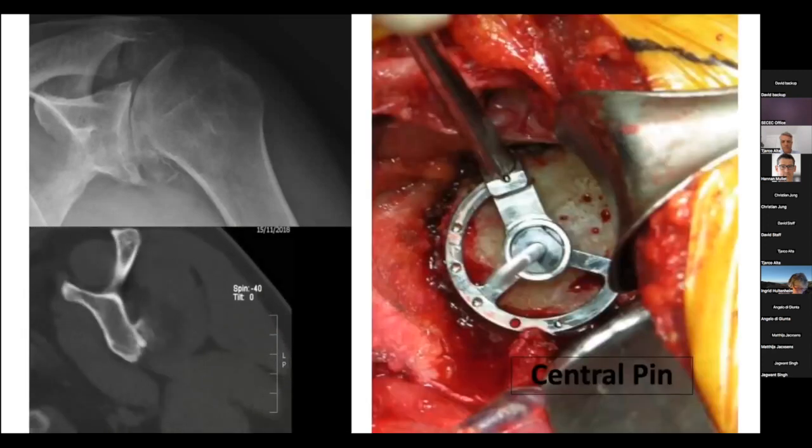At the time of surgery, standard instrumentation is then used to place a central pin that will further guide the preparation and the reaming of that deformed glenoid, and finally also the implant position. Unfortunately, it has been shown that this standard technique does not always result in the best results, with up to 10% of errors or 10 degrees of errors and quite a bit of outliers.